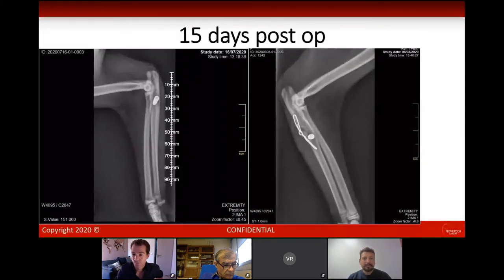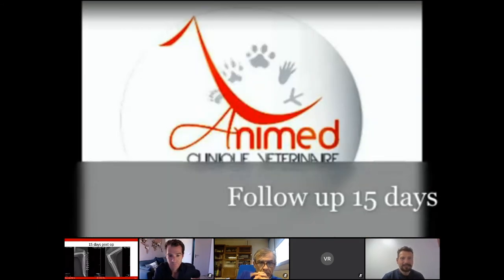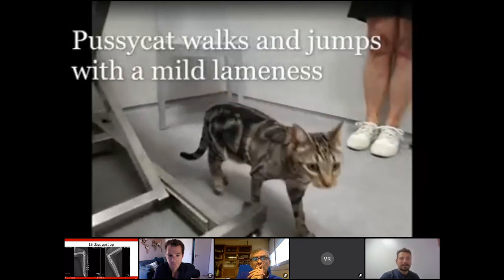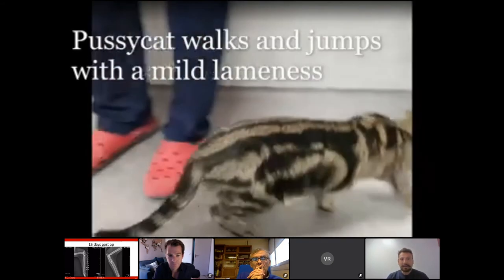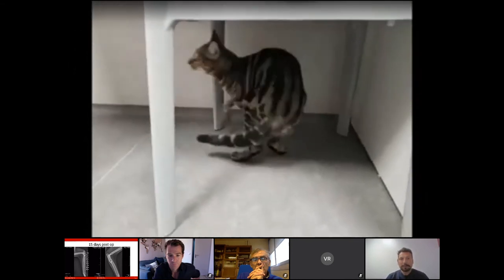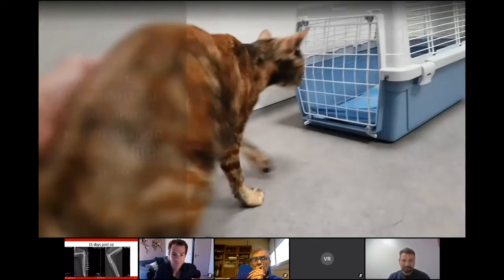So you can see, next slide is okay. Victor, next slide. Oh, it's a video. Okay, we have this 15 days follow-up, as you can see. The cat is walking. This is Pussycat. We are 15 days after surgery. No bandage, and the cat has a good walking.